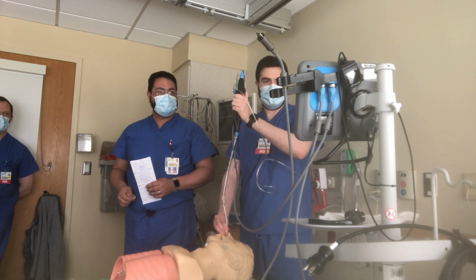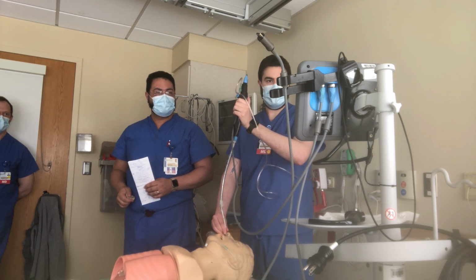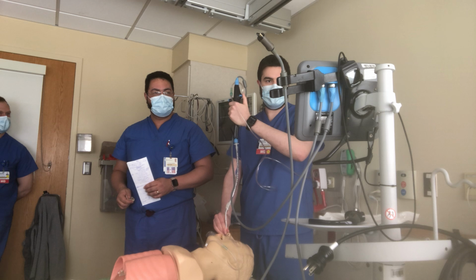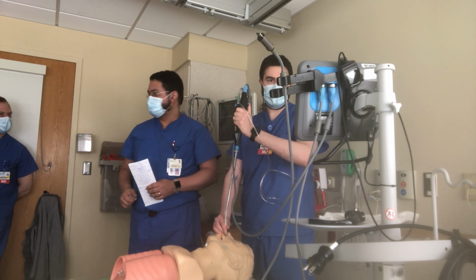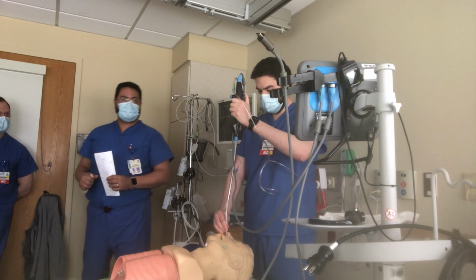Yes. Perfect. Turn. Perfect. Center it. Yeah. Perfect. Retroflex. No, turn. Yeah. Perfect. Good. And who's left there? Professor Drake.